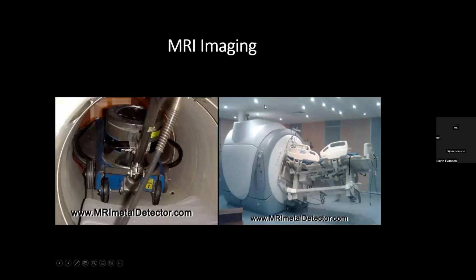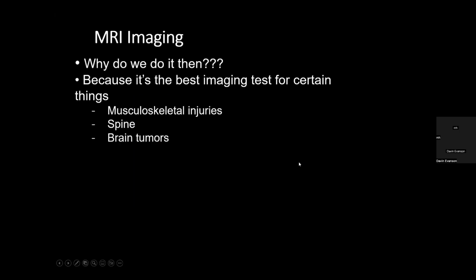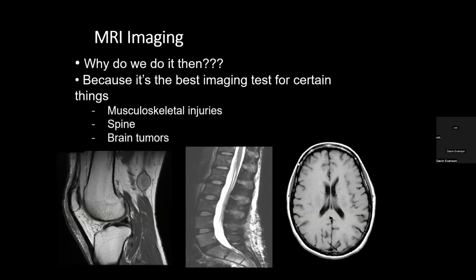They have to quench the MR scanner, basically let out all the liquid helium and reset the MR scanner. And you can imagine also dangerous if a patient were in there. Several fatalities have been related to metal objects becoming projectiles and hitting patients. So MR, though, not to scare you, is fantastic for lots of things. MSK, spine, neuro.